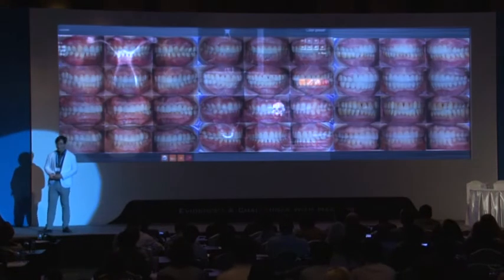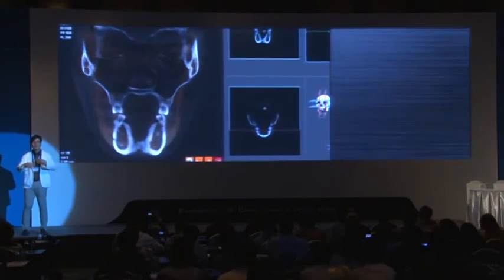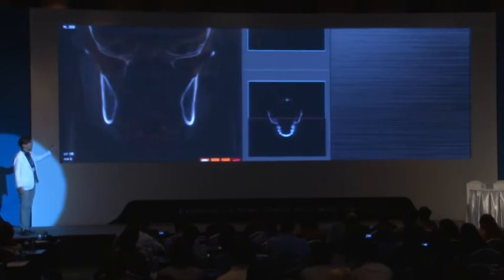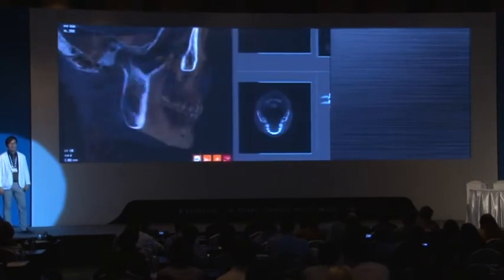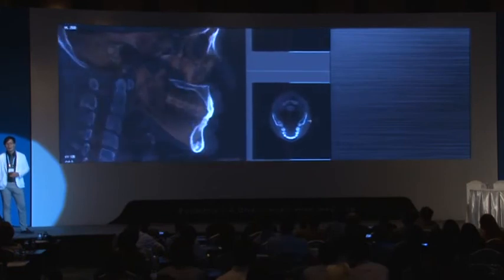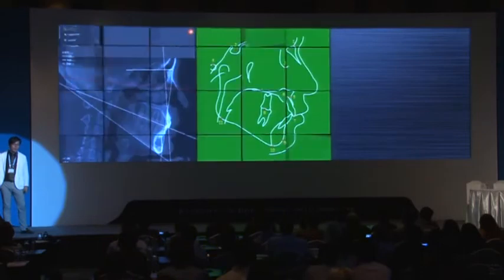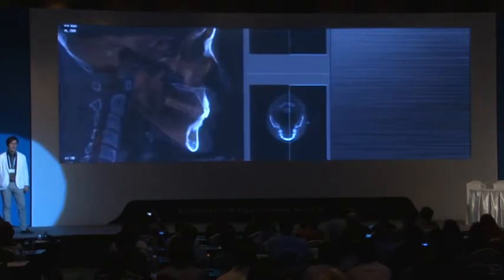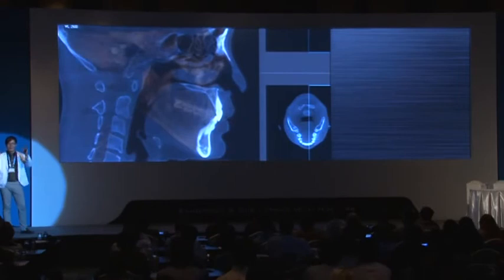So, once we take the CBCT, we can make very nice diagnostic tools. Every cephalo or PA view has many kinds of lines because they shoot one-shot radiography. But the left and right face, and front and posterior face images are overlapped. So we cannot distinguish exactly.